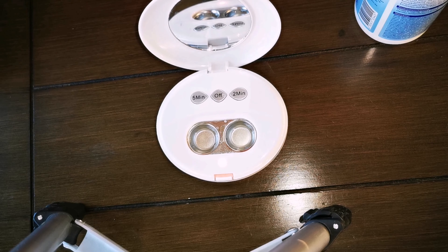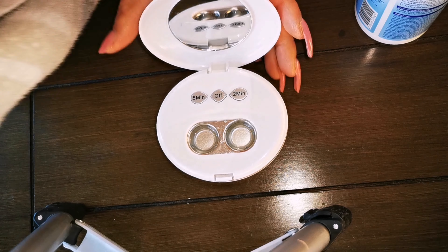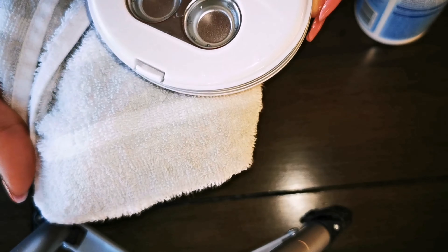What you're hearing right now is the device itself — that's the sound it makes during operation. It's not really that loud, but it does make a sound. Anyway, that's the machine, so let it work and do its job.